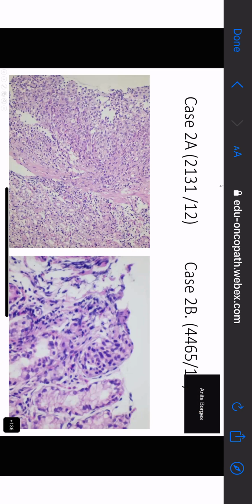Yes, so there is the gastric mucosa, which consists of foveolae, gastric glands, lamina propria, as well as the muscularis mucosae, and deep to that muscularis mucosae, you are seeing this piece of tissue, and there is something that is proliferating over there. Okay. Very good.